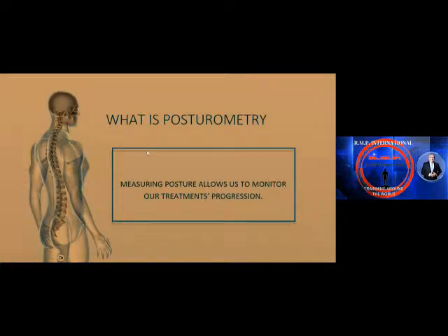What is posturometry? Measuring posture allows us to monitor our treatment's progression, and that's very important in all medical sciences, not only in physical rehabilitation. Every medical science needs to measure their treatment because all the treatments are connected with the body, and we can affect the body with our treatment. I mean dental treatments, insoles, physical rehabilitation, osteopathy, etc.